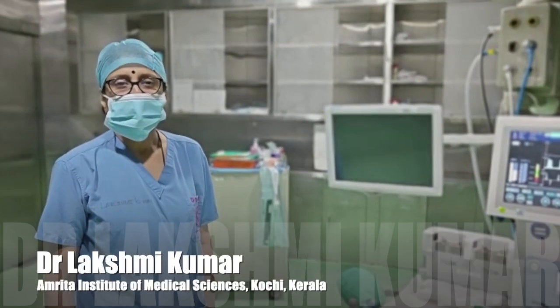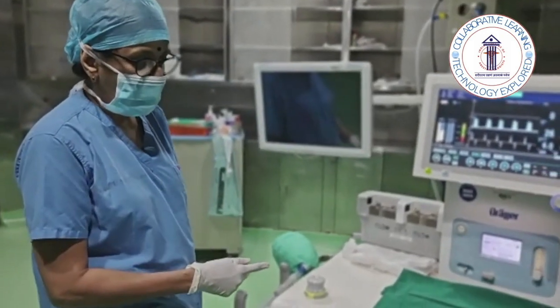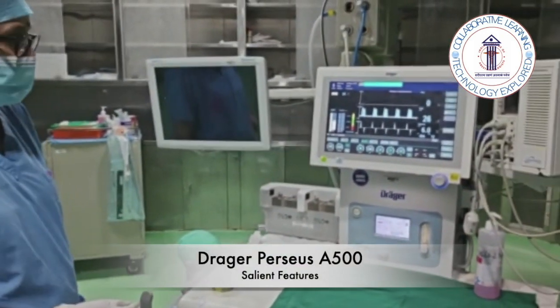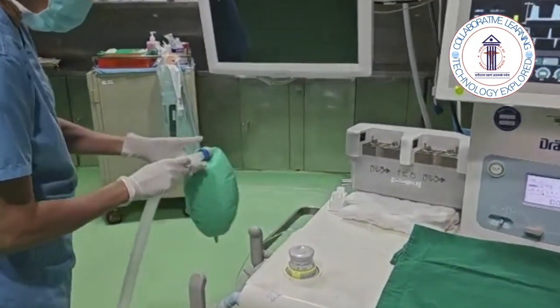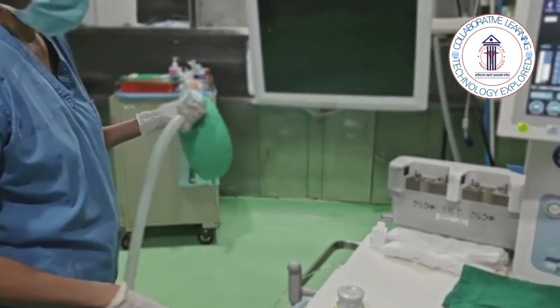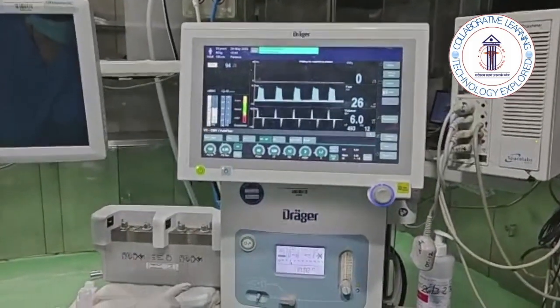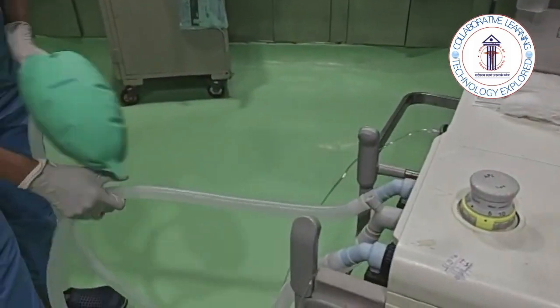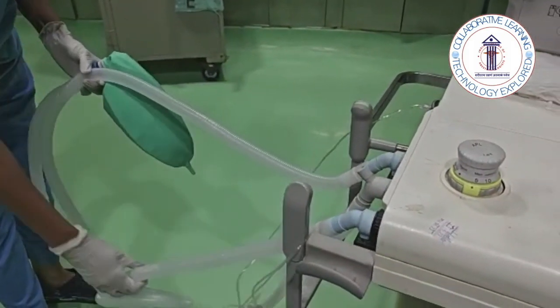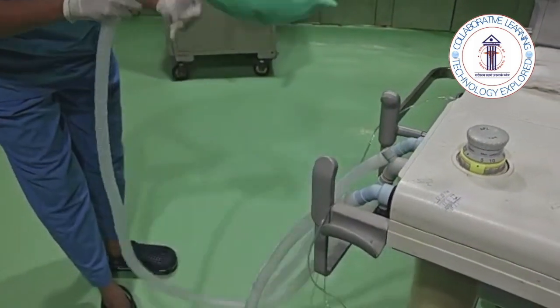I'm Dr. Lakshmi from Amrita Institute, and today I will be talking to you about the Draeger Perseus A500. So as a first part, I'm going to tell you the parts and the circuit. You have the fresh gas setting on the screen. Then you have the circuit which is attached, inspiratory limb, the expiratory limb of a circle system, and you have the connection to the bag.